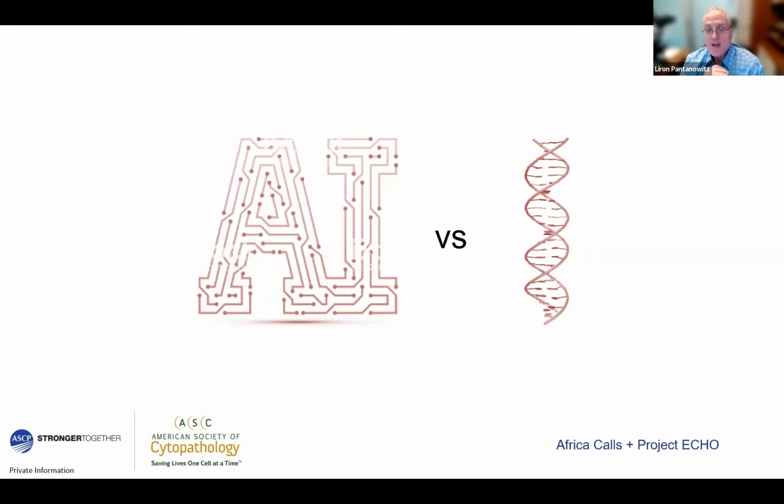So the pap test. The pap test, as you know, for many years has been solved. We screen those looking at cytomorphology. AI now is assisting with that. So should we stick with cytomorphology with AI assistance to screen pap tests, or should we look at PCR for HPV? And many countries are adopting primary screening using HPV testing for cervical cancer. But we do know that there are HPV negative cervical cancers, and some patients are being missed with just primary screening for HPV. I don't know the answer, but perhaps a combination of AI with molecular testing may be the right way to go.